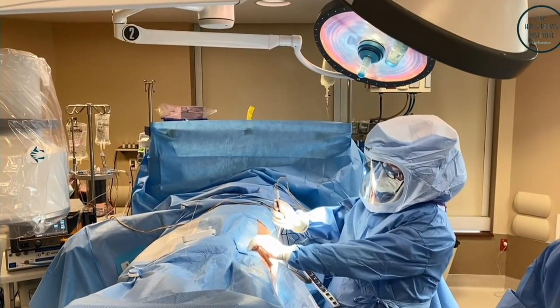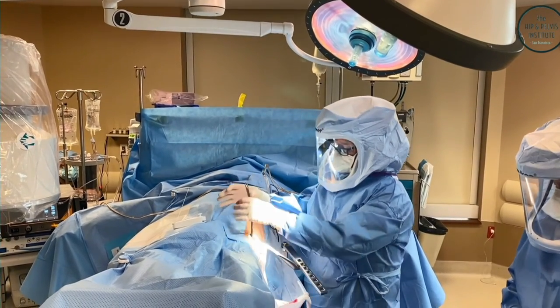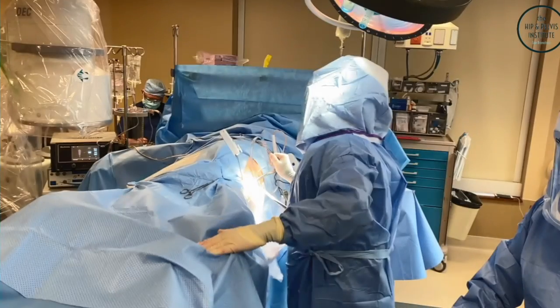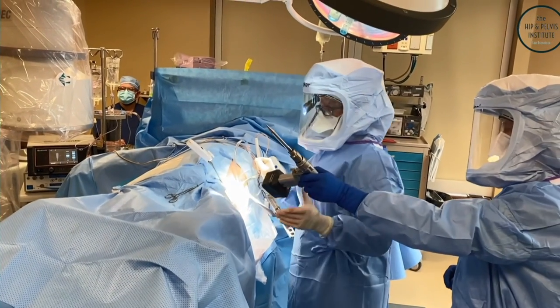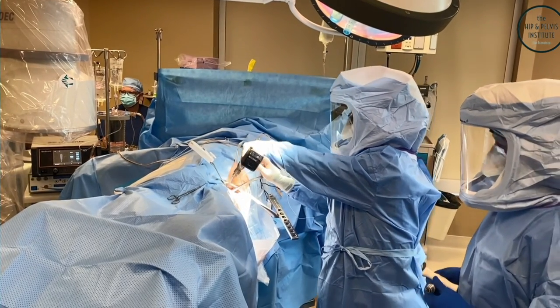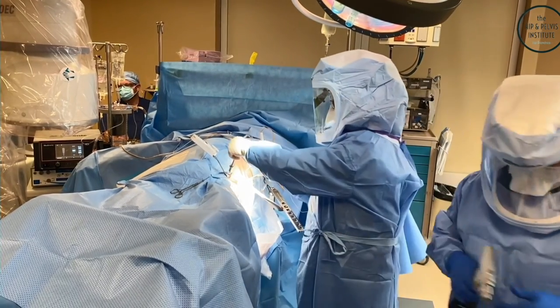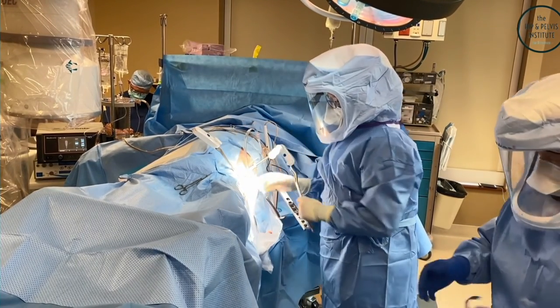And so this is how it works. We're doing our approach. The retractors go in. They're locked to the self-retaining retractor system. And we go hands-free. And through the procedure, the various steps of the procedure, we're actuating the self-retaining retractor system with one finger. I do a dislocation first technique if you're wondering what's going on here. Not many people do that, but I learned that from one of the best.